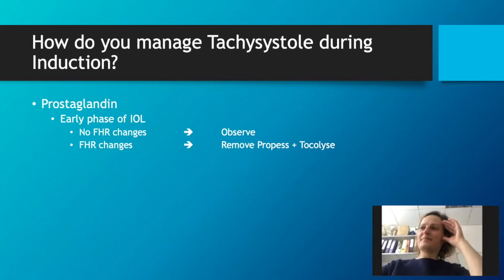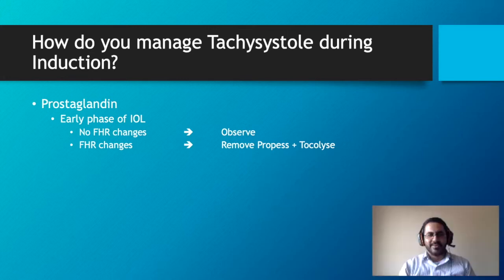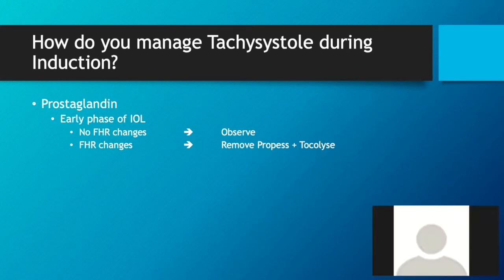Now, if you've taken the Propess out, would you ARM her? Probably wait a bit just to see what happened. Okay, contractions are not settling. Would you ARM her? And what's the baby doing again? The baby's now just about settling.